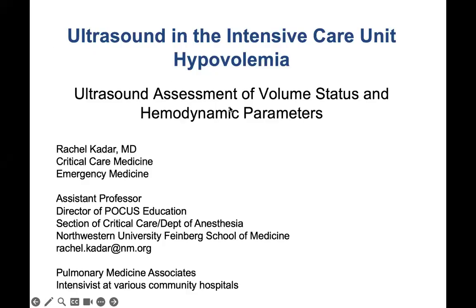All right, so my name is Rachel Kadar, and today we're going to be talking about ultrasound in the intensive care unit, hypovolemia, and more specifically, we will talk about ultrasound assessment of volume status and hemodynamic parameters.